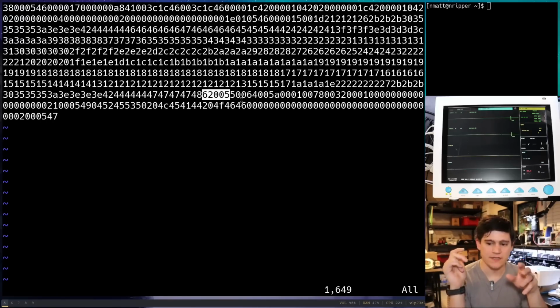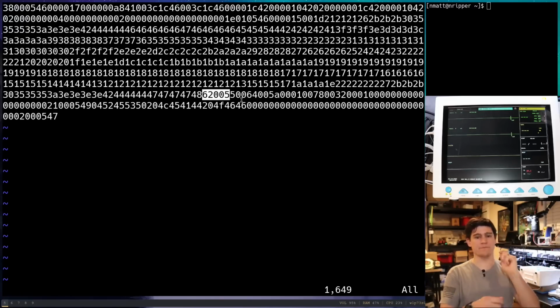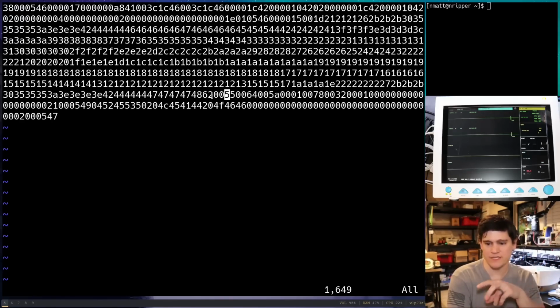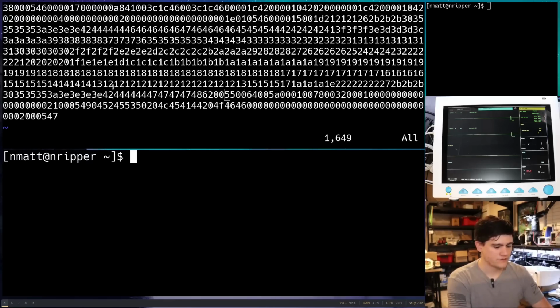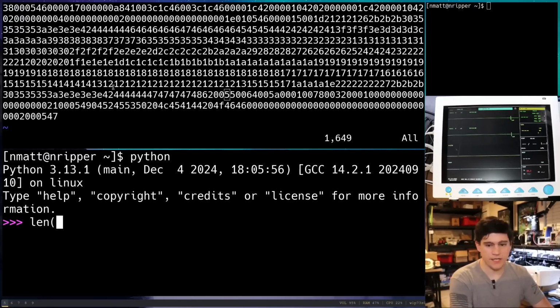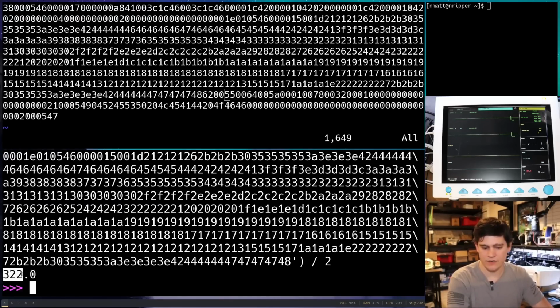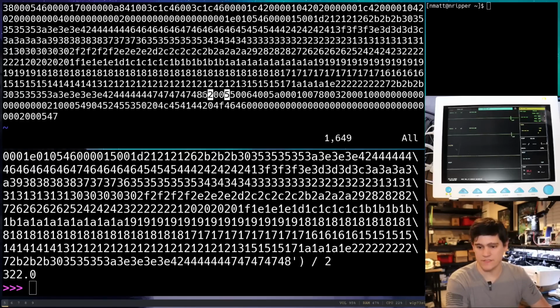Each of these are 2 byte values, but usually you would expect it to be flipped if it was little endian. But since these are bytes traveling over a network, typically network byte order is big endian, which means the bigger part is at the front. And so what we want to get is the offset here. So we're going to open up our little Python shell and say length of this string divided by 2. And there we get 322. And that is the offset to get us to this byte right here, this 62 byte.